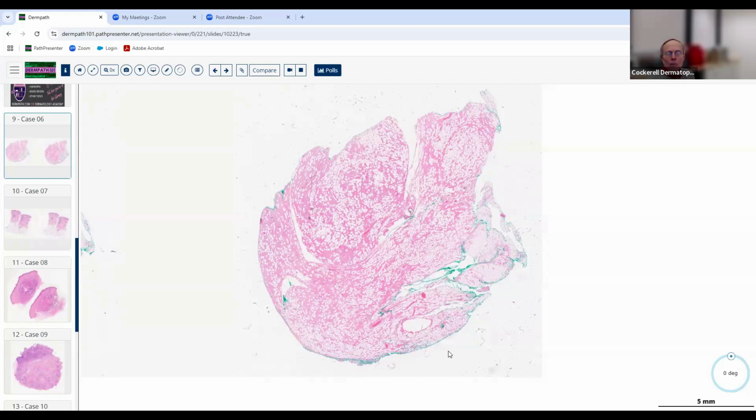And there's a reason for that. That's associated with the lesion being well circumscribed. We always talk about things being encapsulated. Often there's really not a true capsule, but it's actually compression of the collagen bundles at the periphery of it. It looks like a capsule, but it's a sign of well circumscription. Cancer, the crab, the cells intercalate between the collagen bundles. It's not well circumscribed in the vast majority of cases. So those don't shell out, whereas benign lesions do shell out.